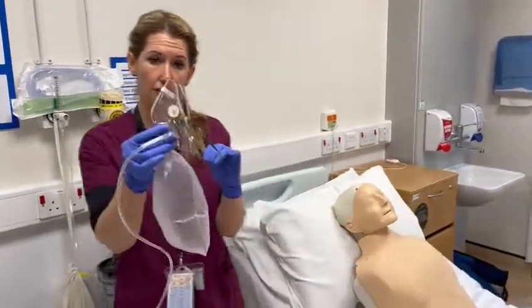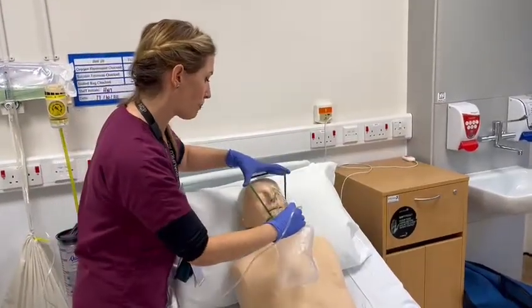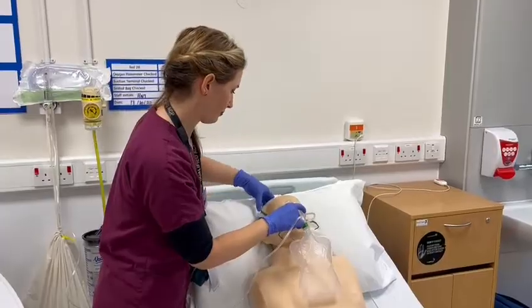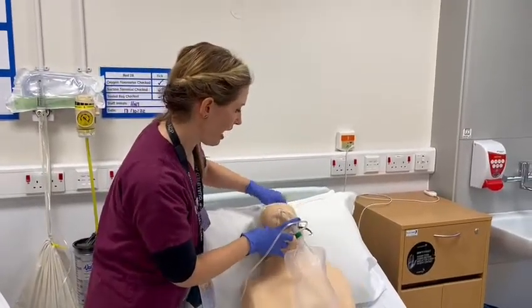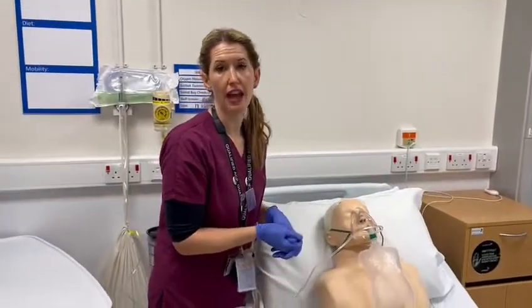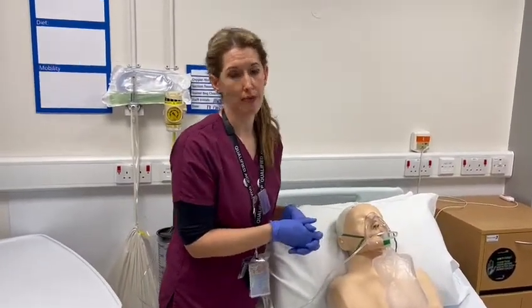I would then go across to my patient, explain what I'm going to do, and then just pop that over their face, three elastics around the back, and then tighten it up. I would then obviously be having oxygen saturations monitored continuously in the next few minutes while they await medical review.